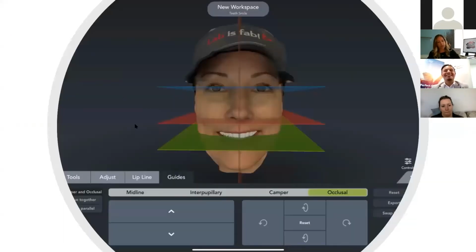So, discussion here, just very briefly, we've been tinkering with the Bellis application. We're not necessarily importing the smile designs we do off the TRIOS into the dental manager, because we've been utilizing the Bellis software. It's been really useful for us because it gives us so much information.